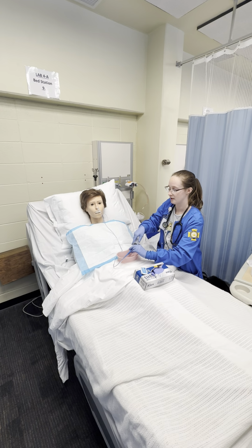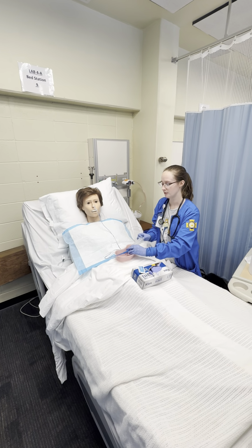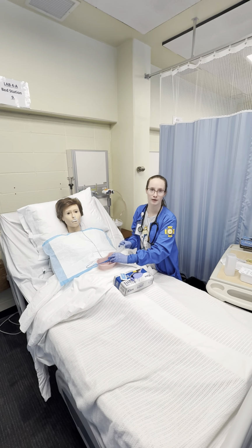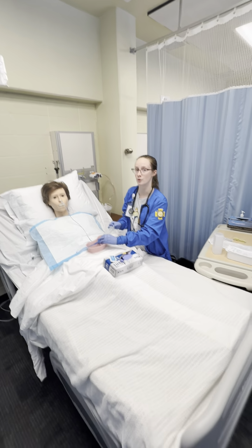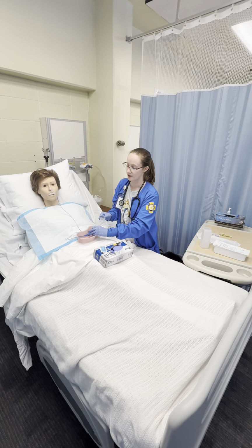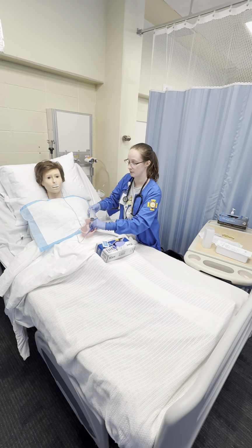then when I'm aspirating the stomach contents, I'm looking for a greenish brown color, a little bit of yellow, like a bile color. If I get clear or anything frothy, it indicates I may be in the intestines or in the respiratory system. Because this is not a real person, we're not going to have the stomach content color and consistency that we're assessing for.